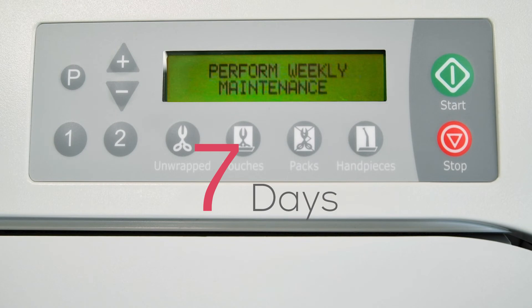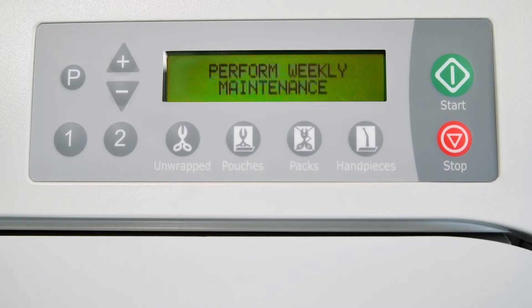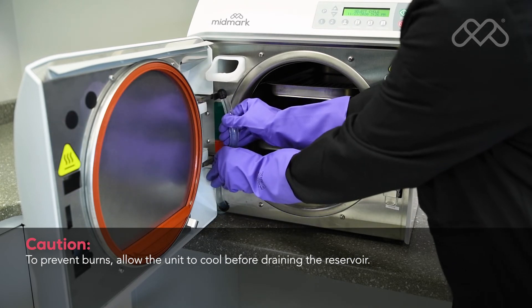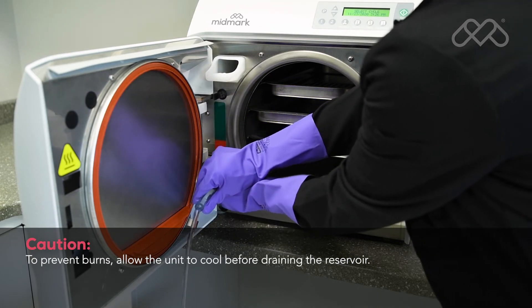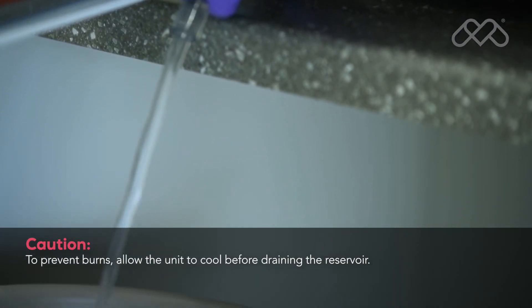Every seven days, the sterilizer will automatically display the Perform Weekly Maintenance message. If the power is disconnected, the cycle of weekly messages will be reset. Disconnect the upper portion of the reservoir drain tube from the panel clips, bend it downward, then drain the reservoir water into a suitable container and dispose of the water.